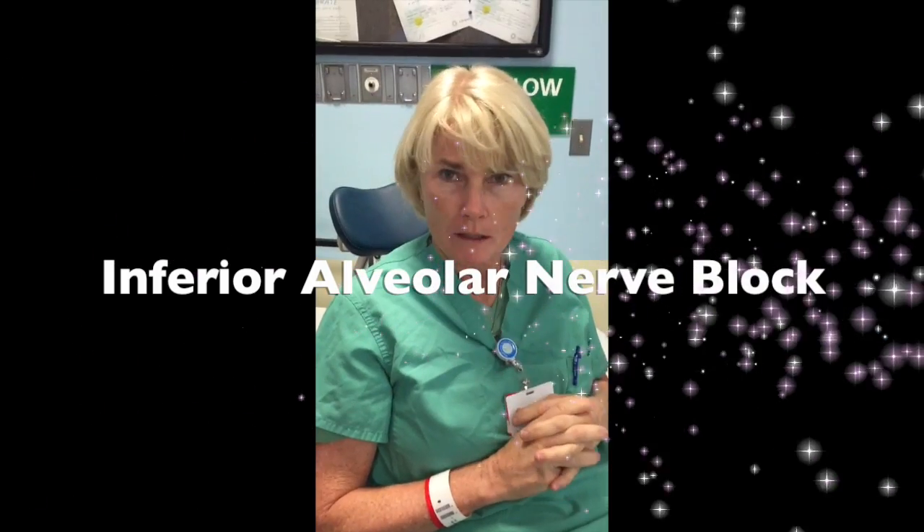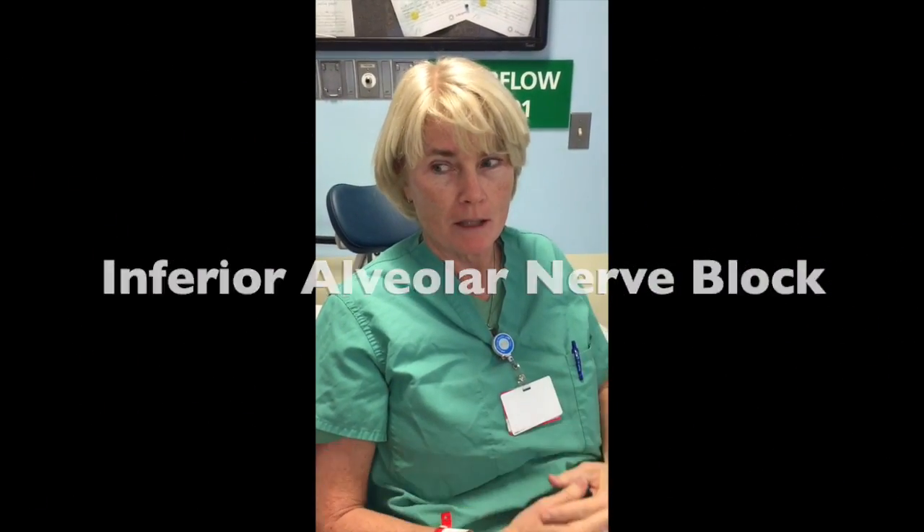Extra, extra, read all about it! Hello bloggers, we're going to do an inferior alveolar nerve block for my dental abscess so I can work.